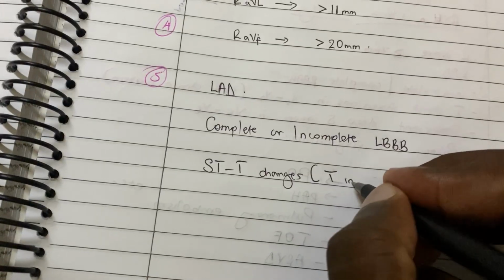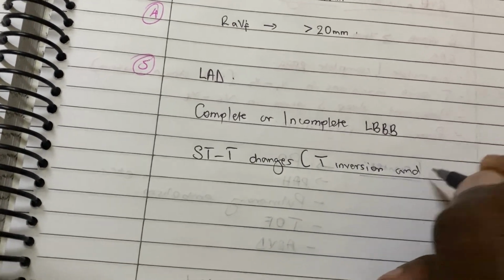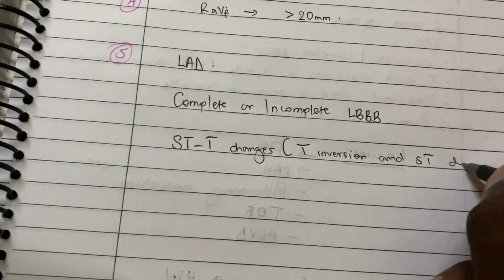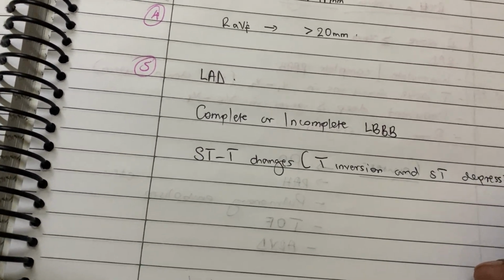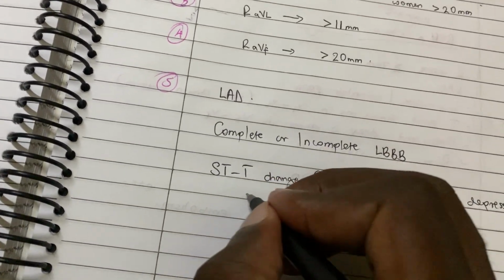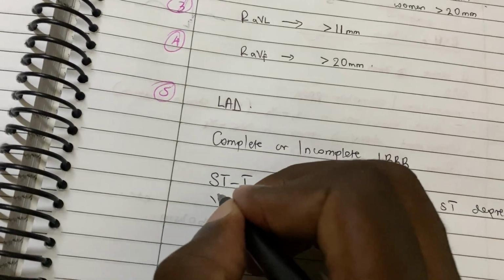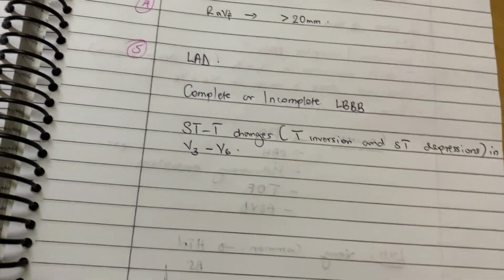T inversions and ST segment depressions in V3 to V6.